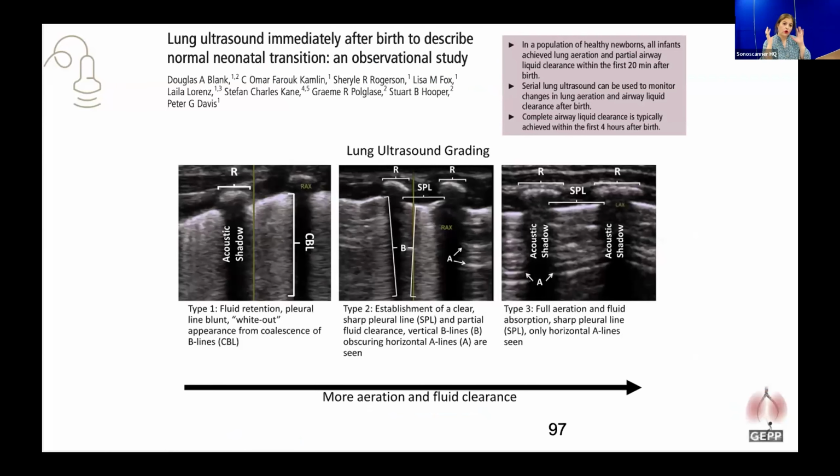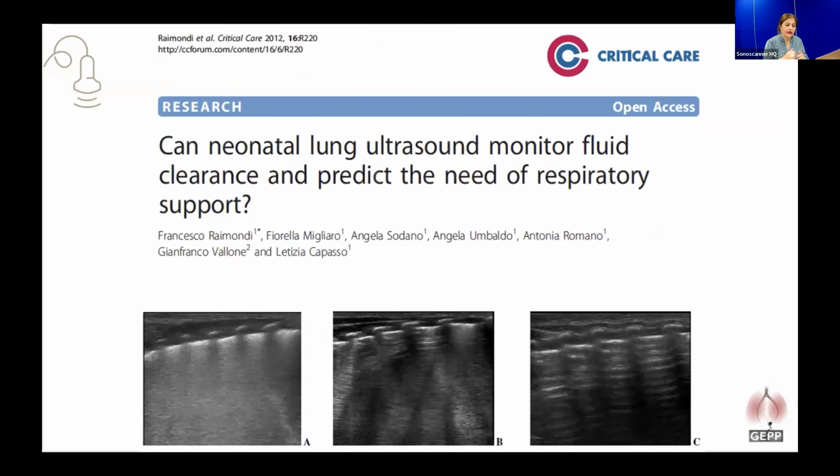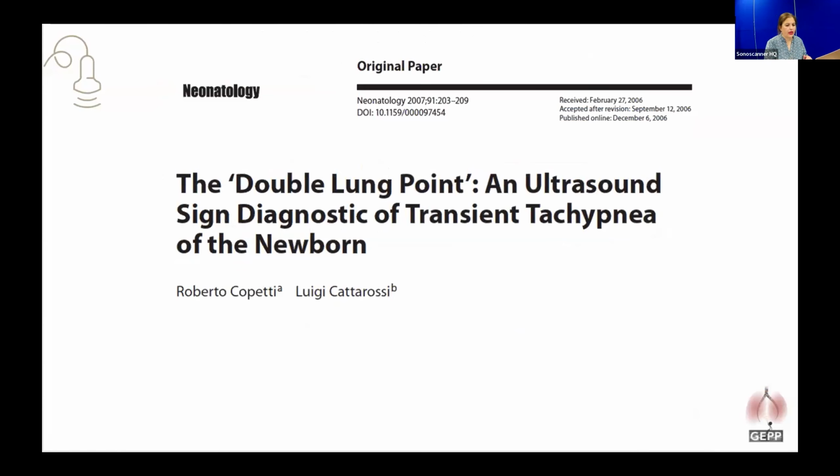And for most babies, this will happen within the first hours of life, although some will need up to 24 hours or more. So it goes from a consolidation before the first breath, then you've got a white lung appearance, and very quickly you start to have areas with well-defined pleural line until you clear mostly. And static compliance goes up. So basically it's a 1, 2, 3. And we know by using these patterns 1, 2, 3, we can actually predict which babies will go on to need admission to the NICU for respiratory support. Babies who have trouble clearing their lungs have a higher risk of needing CPAP or non-invasive ventilation or more later on. What about the babies who have problems, who need admission?